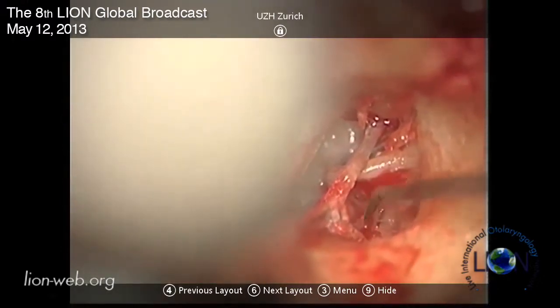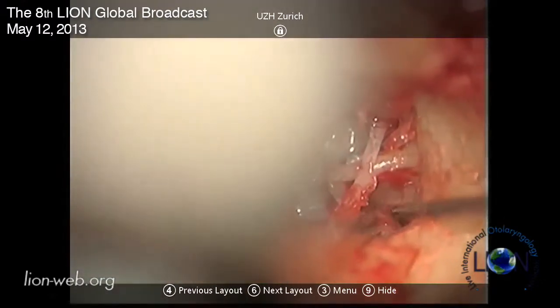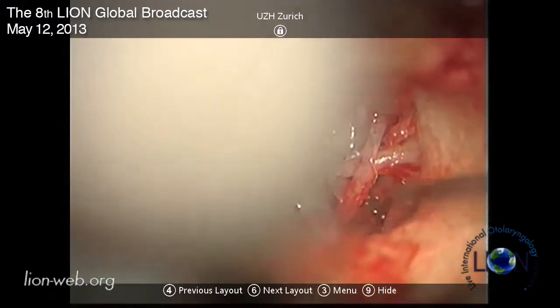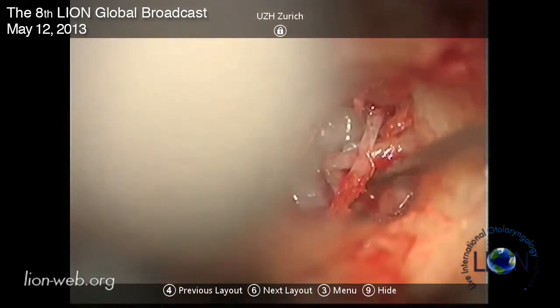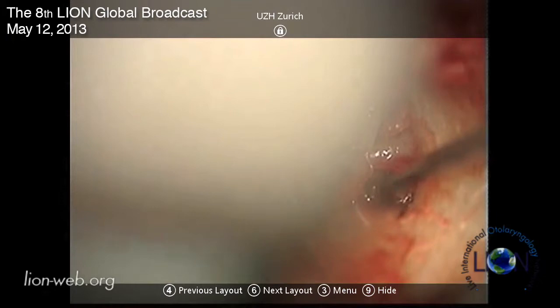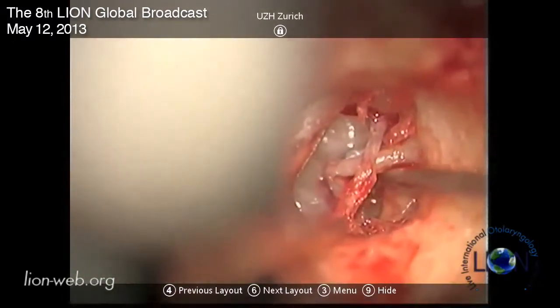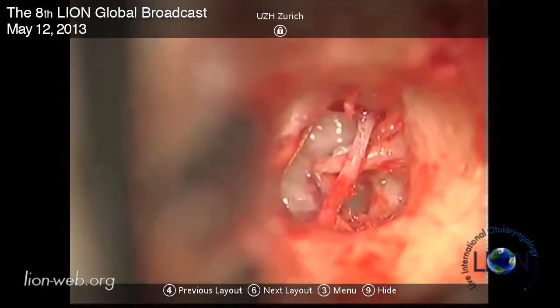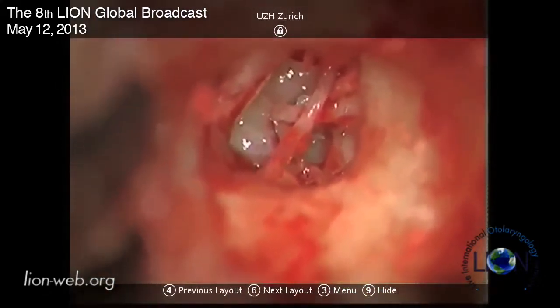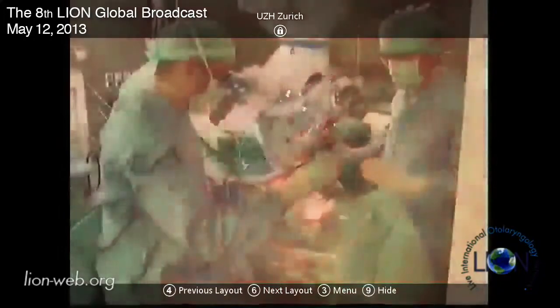Here we can see the pyramidal process. I just open all these mucosa parts - I think that's very important so that you have good access. Can I have a little bit more of this mucosa part removed? It seems like there's a big enough space here to put a 0.6 prosthesis in afterwards.